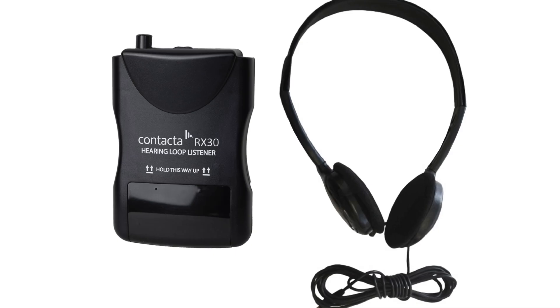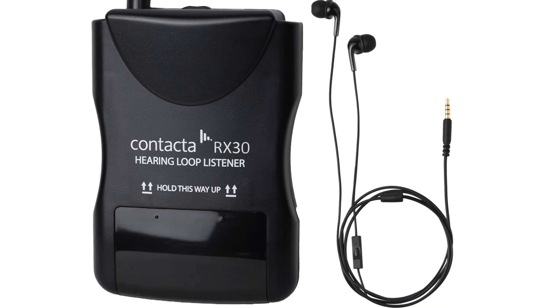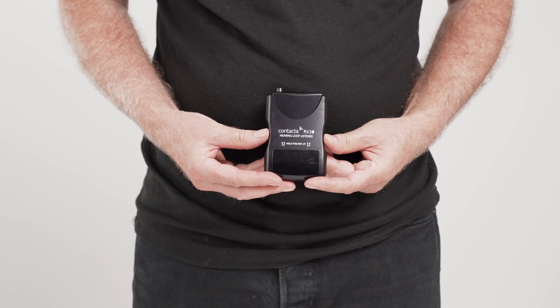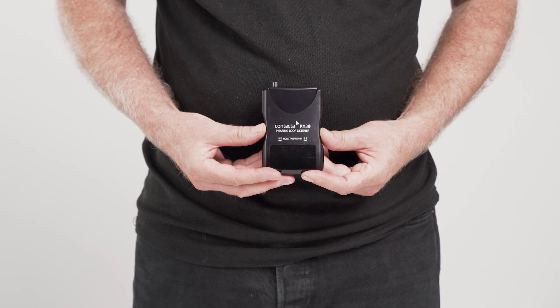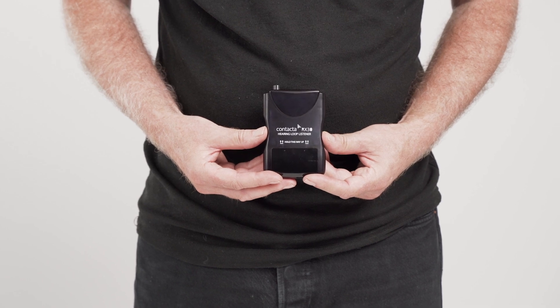When using the device, plug the headset into the listener via the 3.5mm audio jack, then place the headset over both ears. Keeping it in a vertical position, adjust the holding height or lanyard toggle to find the optimum sound level and quality. This can vary depending on the installed hearing loop location. You may find that the sound quality is best when the device is held at a level close to head height.